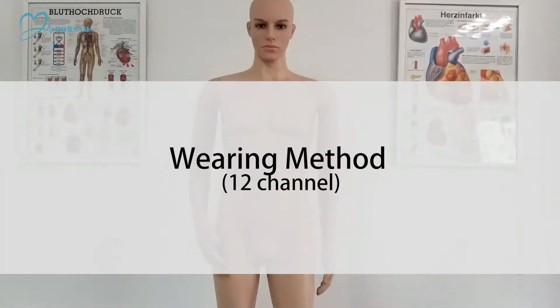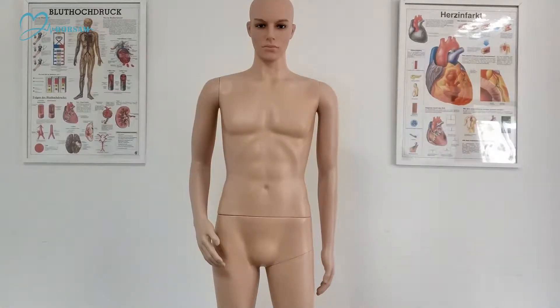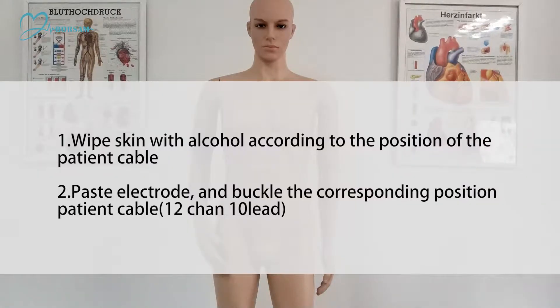Wearing Method — 12 Channel. Step 1: Wipe the skin with alcohol according to the position of the patient cable.